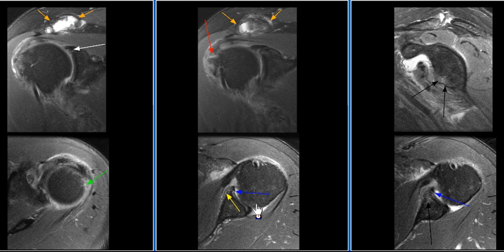50-year-old male with history of trauma two weeks ago complaining of shoulder pain. MRI examination shows avulsion of the anterior inferior labrum.